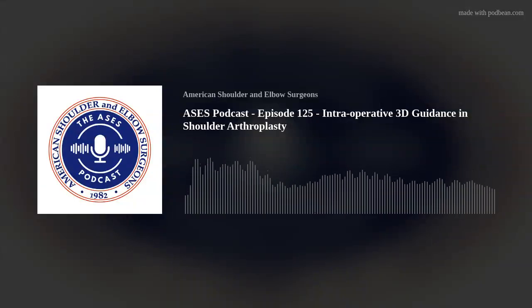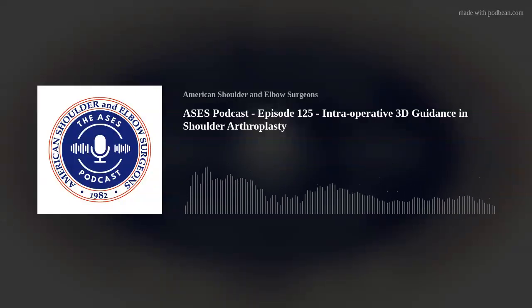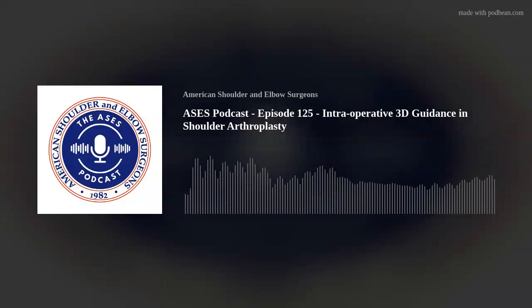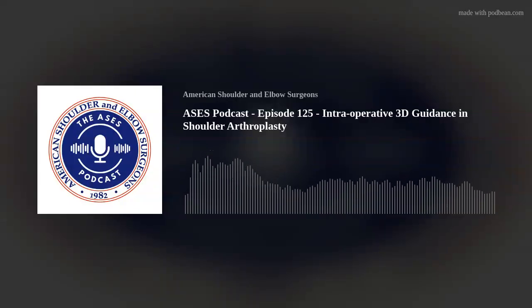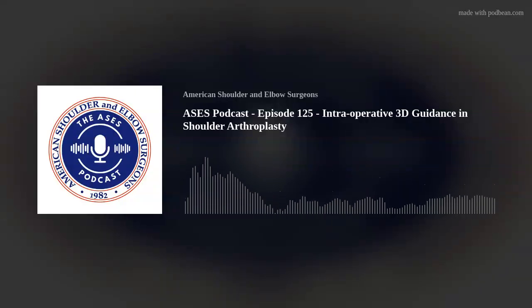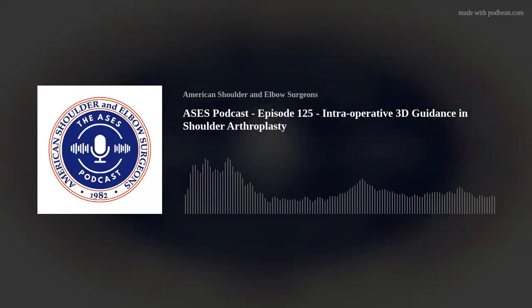I actually have a PSI guide for my humeral side, Peter, and my glenoid side, not just the glenoid side. So my humeral cut is done PSI guided, bio-RSA is done PSI guided, and then I execute my glenoid plan PSI guided, but I will bring in navigation when I feel there's so much bone loss that I want to get the screws in exactly the right position with the good length. And so I think that's what I try and do at this point in time.